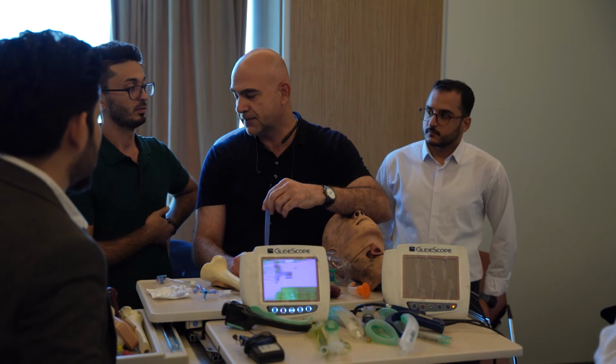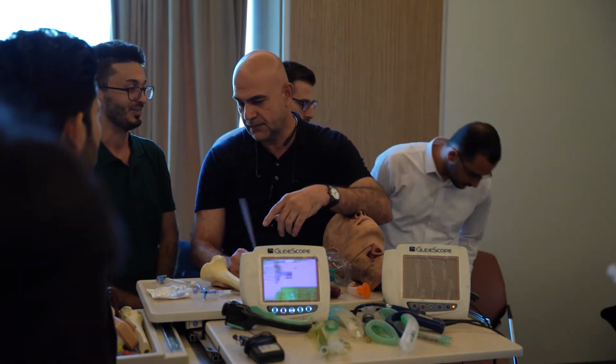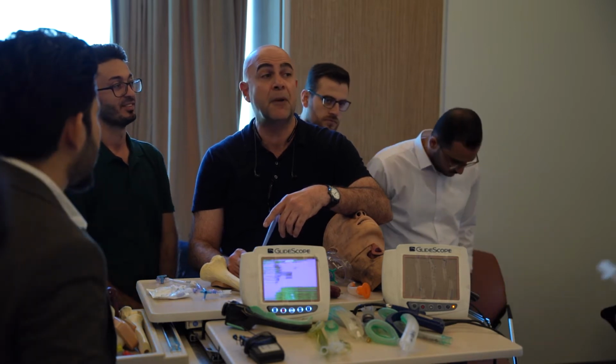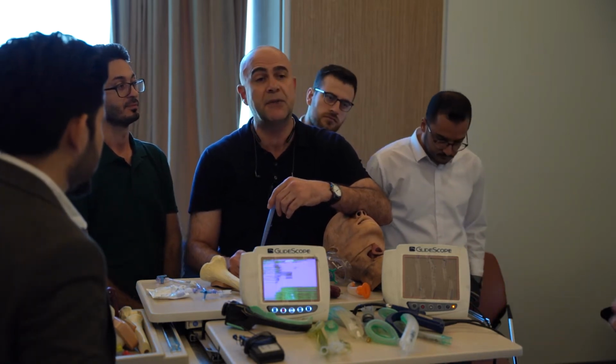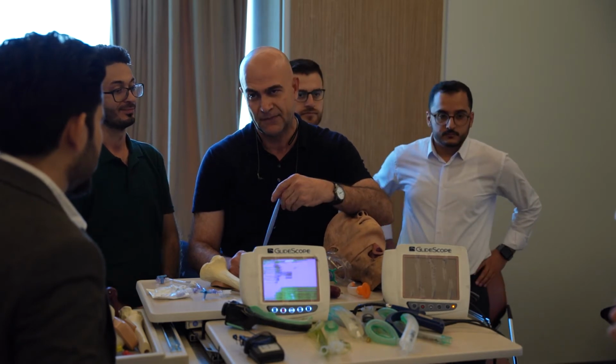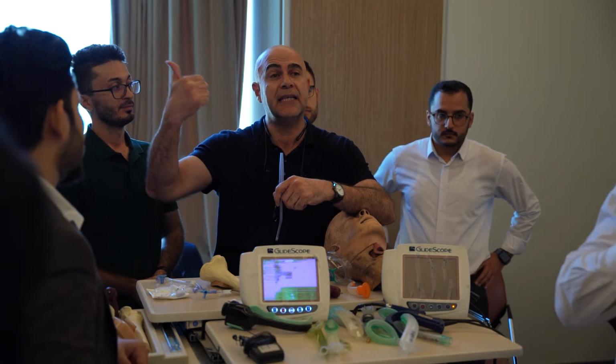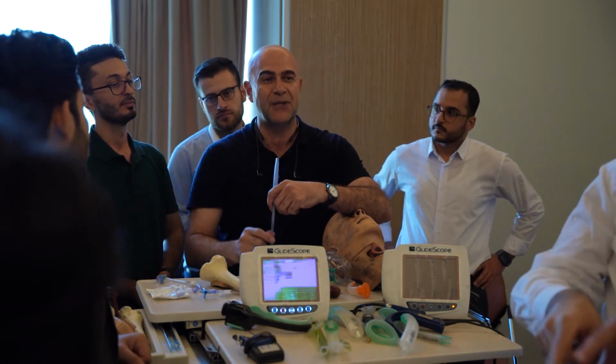end-tidal CO2. What is the normal end-tidal CO2? I don't have an idea. Well, it's up to 40 mmHg. If you reach 35 mmHg, this means the patient has good perfusion, and it is one of the clues to see your patient's return of spontaneous circulation.